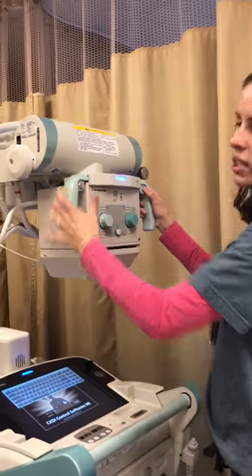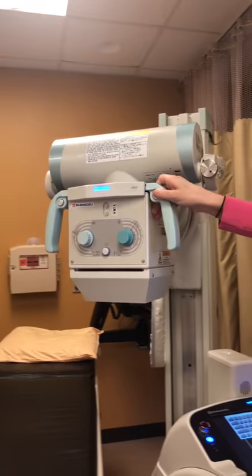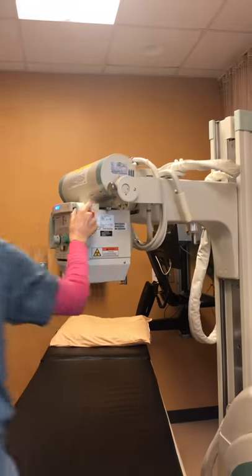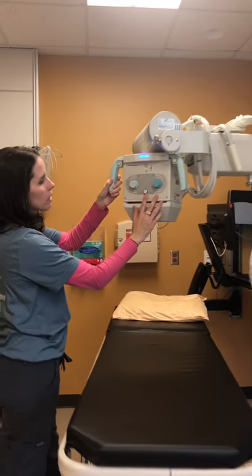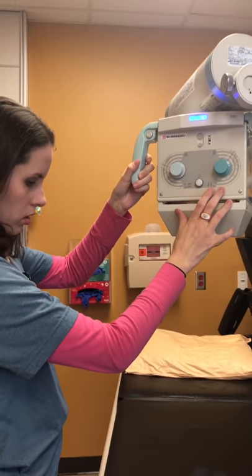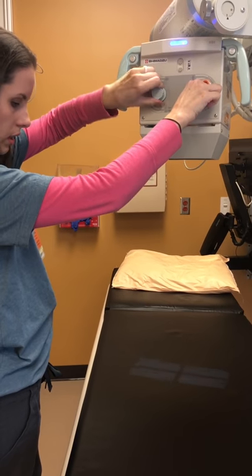In order to move the machine itself you have to enable these buttons. Your collimator light button is this white button here — if you hit it you're going to see the light here.